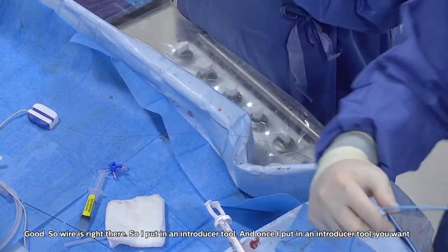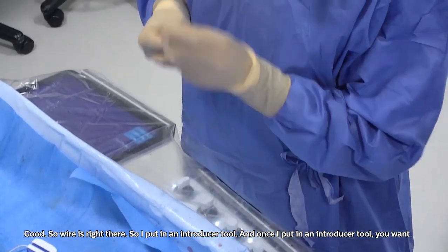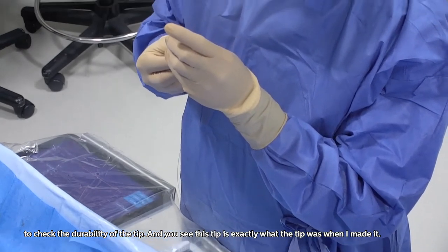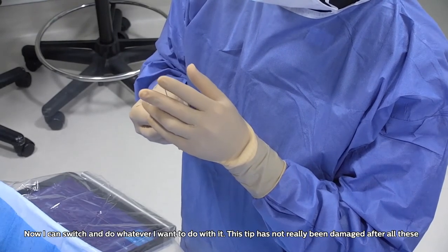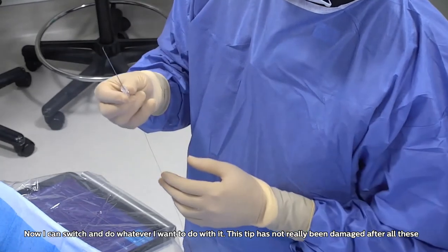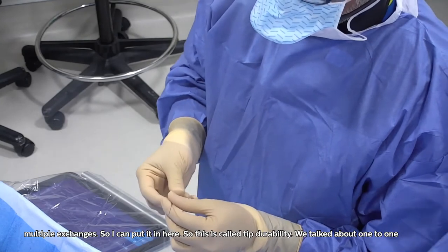So I put it in an introducer tool. And once I put in an introducer tool, you want to check the durability of the tip. And you see this tip is exactly what the tip was when I made it. Now I can switch and do whatever I want to do with it. This tip has not really been damaged after all these multiple exchanges. So I can put it in here. So this is called tip durability.